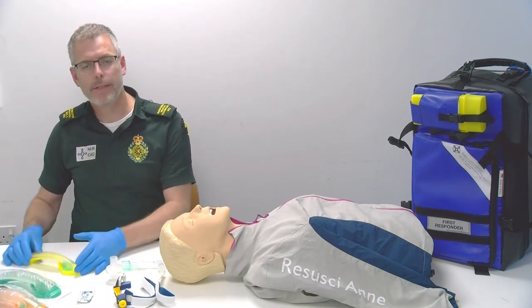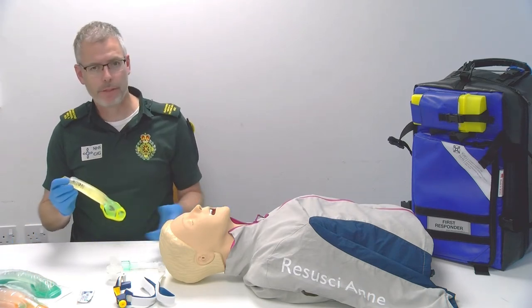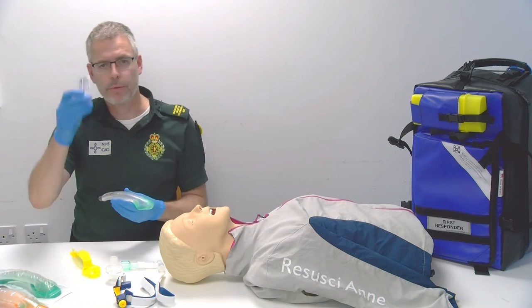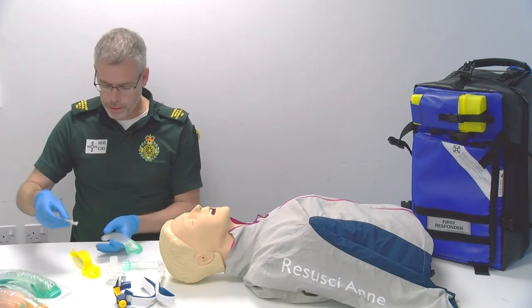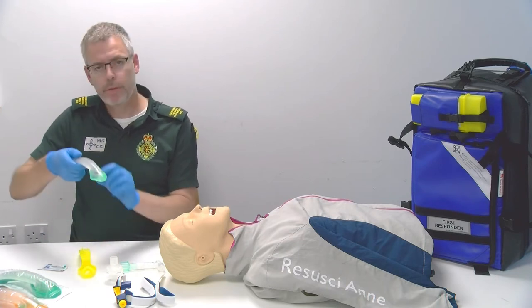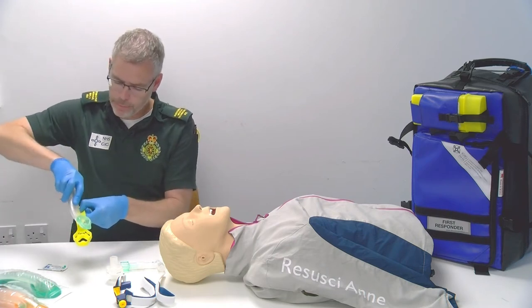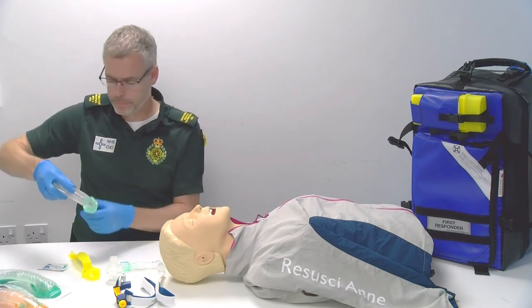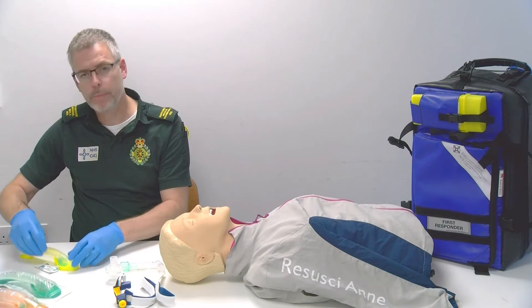Let's look at the technique of preparing the iGel. I've selected the correct size for the patient. I remove the iGel from the cradle. I'll use one sachet of lubricant and I'm going to introduce the lubricant to the body top part of the cradle. I'm then going to lubricate the rear end of the iGel and then just a very small amount on the tip of the iGel. I'm going to then place the iGel back into the cradle, lubed ready to go.